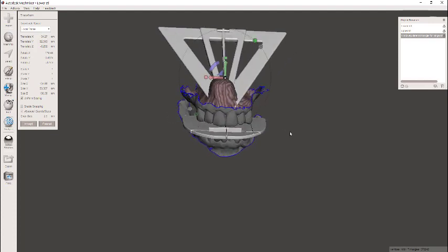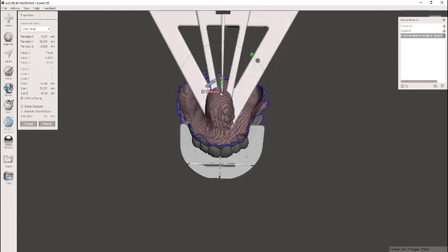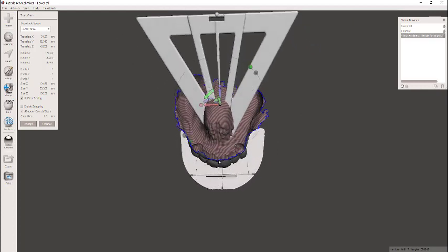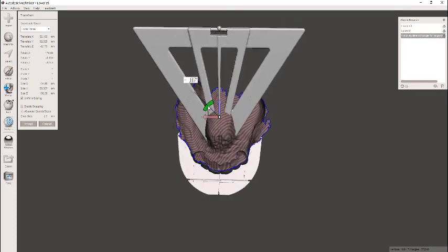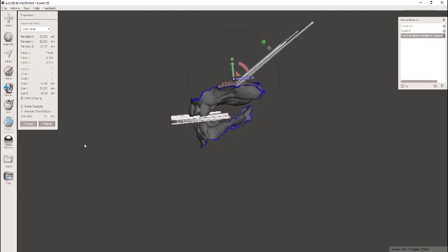And then remember too that part of the reason for the plate is so that you can look and make sure that you're not canted with your models too far this way or that. And so I'm just referencing the mid-palatal suture going through this middle component, and then I just want to align the midline. Okay, there we have it.